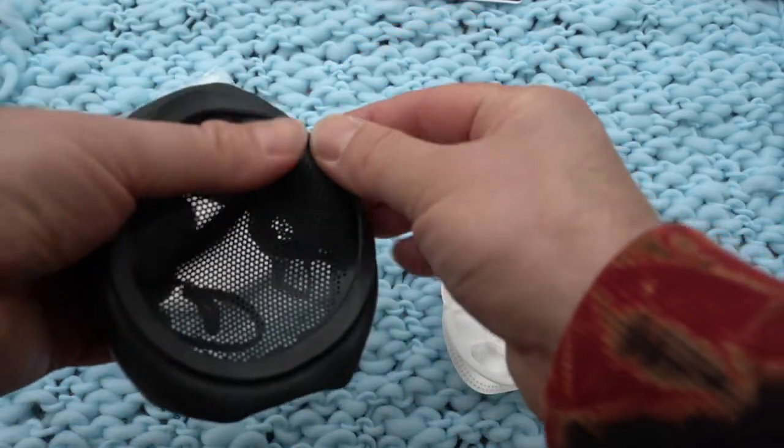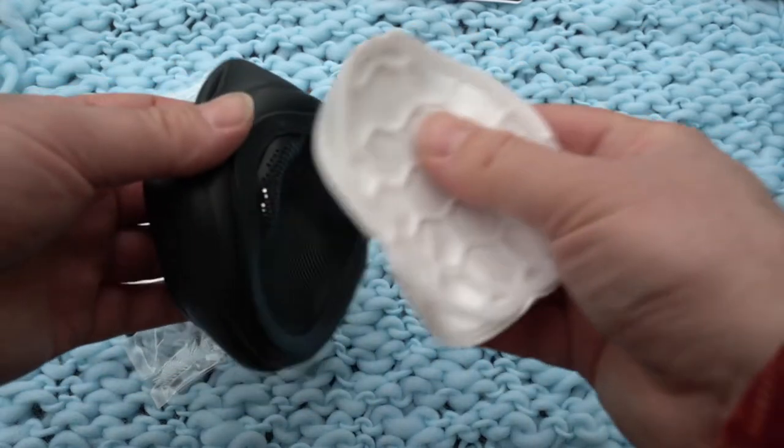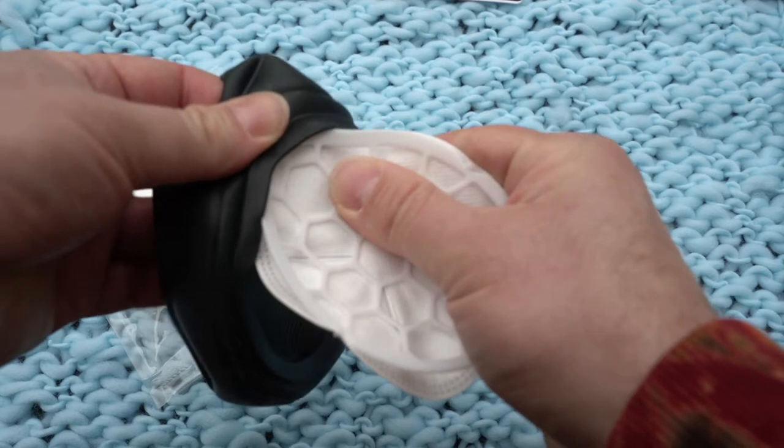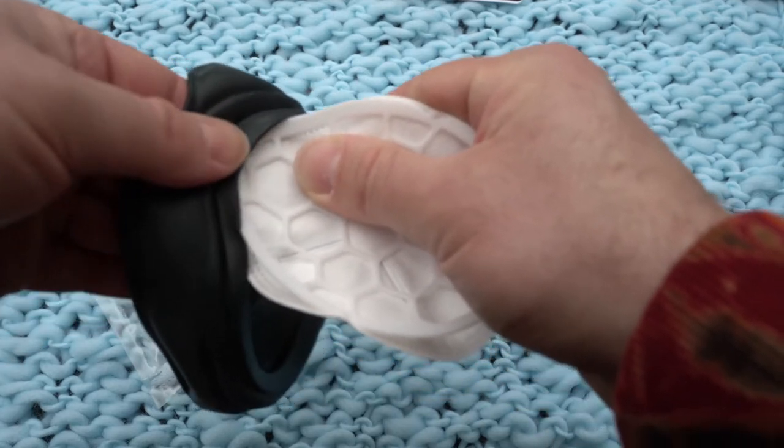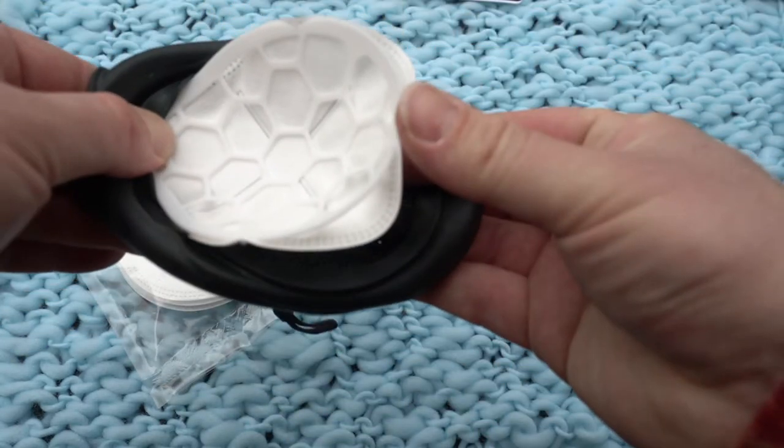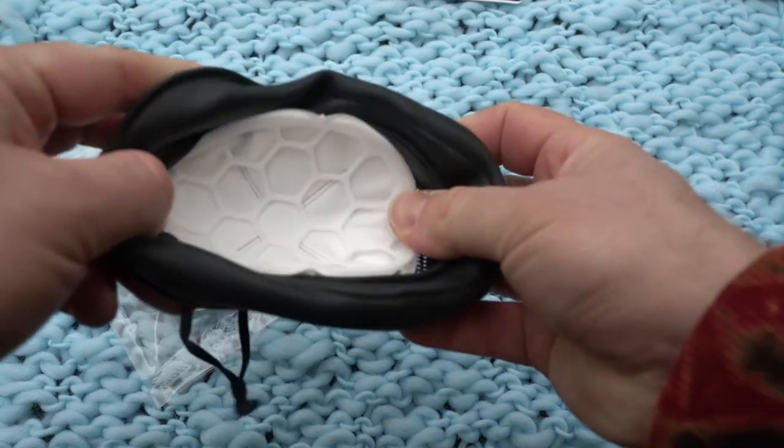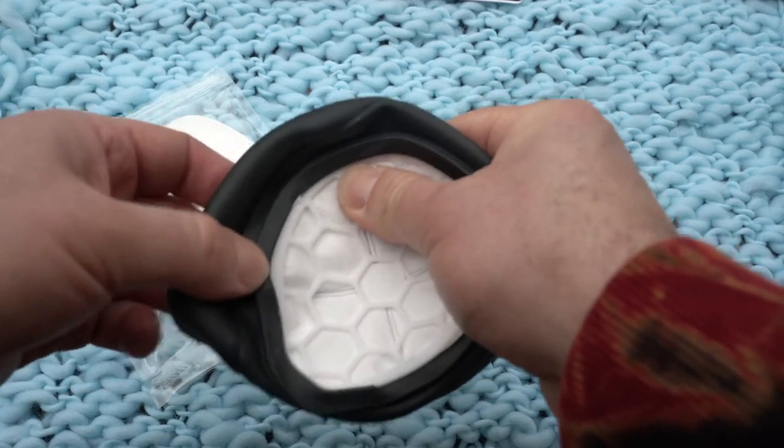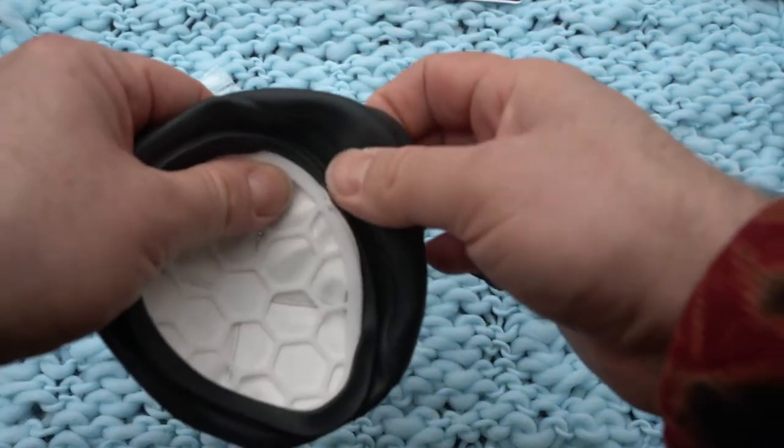There's a lip here on the inside. You just need to put the filter and filter frame combo into the mask. I'm just going to pinch it and push it. When you buy the mask, it comes with two reinforcement frames. You only need one, the other is an extra.